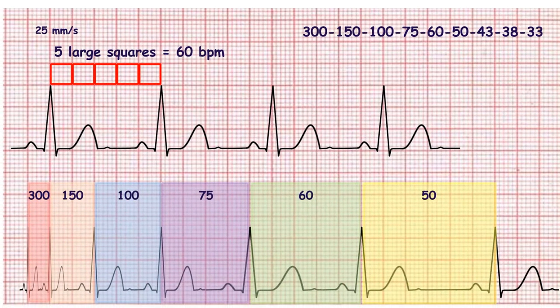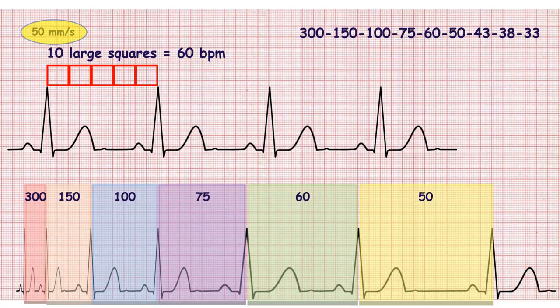The first large square, or five small squares, denotes 300 beats per minute. The next one denotes 150 beats per minute, and so on. If ECG speed is 50 millimeters per second, you can use this same sequence, but in this case you should count every two large squares.